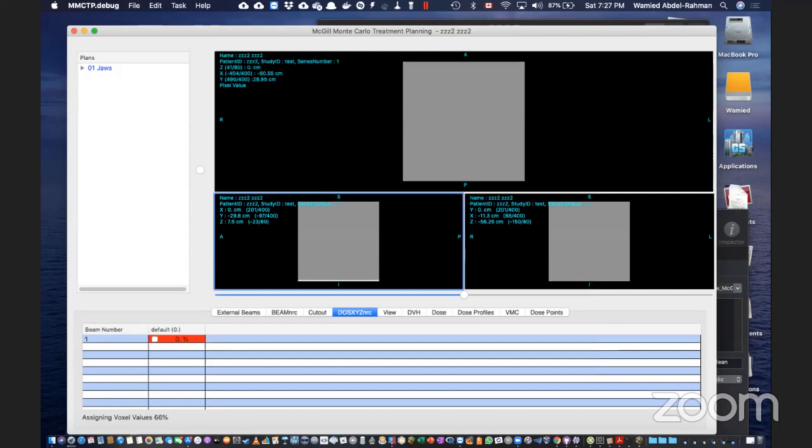So when we look at the profile, let's say at Dmax or at isocenter, then the profile for the jaws and the MLCs should match, within agreement. But I was seeing something different. The profile with MLCs was about 6 millimeters larger than that for the jaws. And this is due to one of two things. Either where I have placed my MLCs with respect to the source is wrong, or the MLC dimensions, the widths of the MLCs, are wrong.